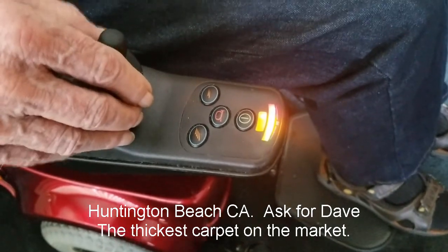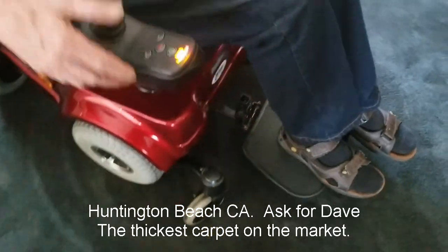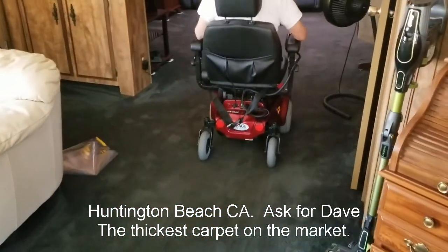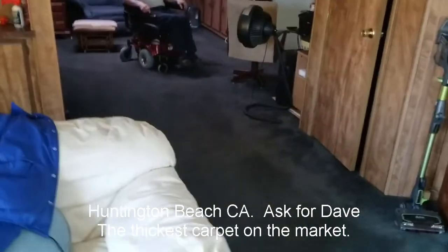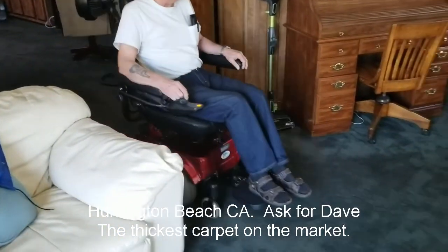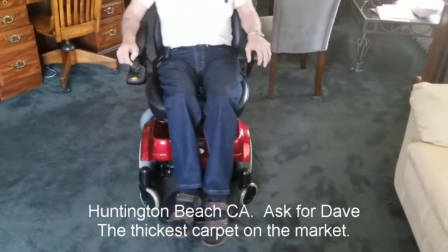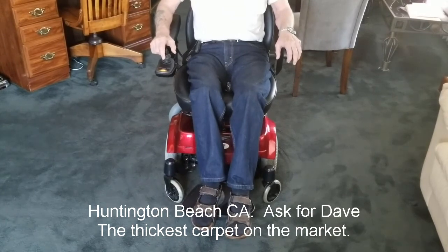Let's put it on the top speed. So there's the top speed. We'll take this for a little spin. We don't have much room, but it can spin on a dime, turn on a dime. Do a complete 360.